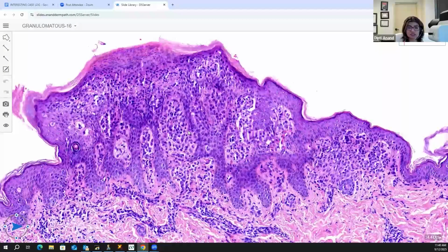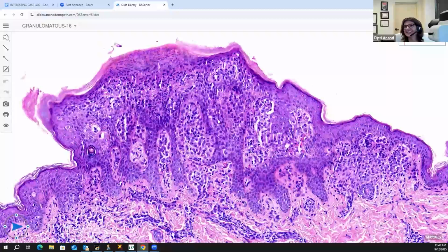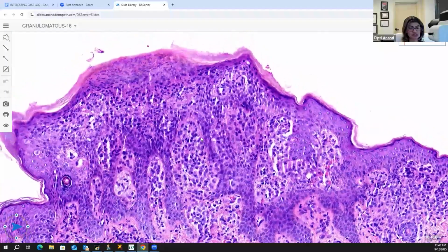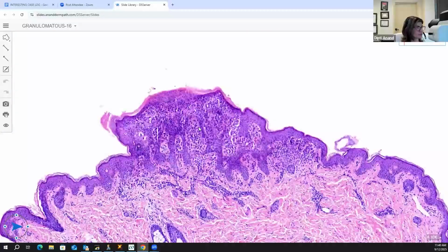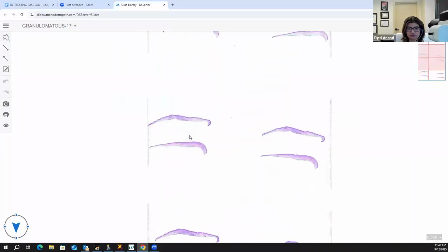Now Hashimoto-Pritzker disease, which is your congenital self-healing reticulohistiocytosis, would also look similar. So does everybody get that? All good? So you know all your second order questions, the Birbeck granules, the CD1a, S100, Langerin, are the mimickers of the same entity, which would be the self-resolving variant of it, which is the Hashimoto-Pritzker. So they all will look similar. Okay, good. Let's go to the next one, which is your slide 17.